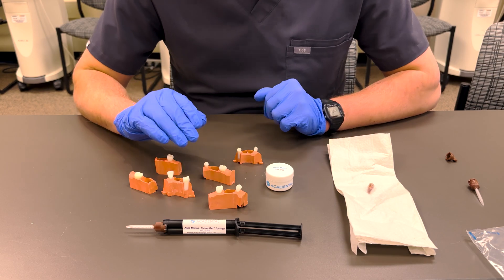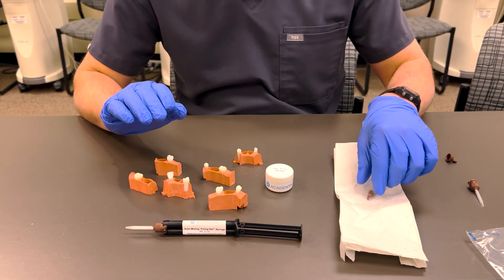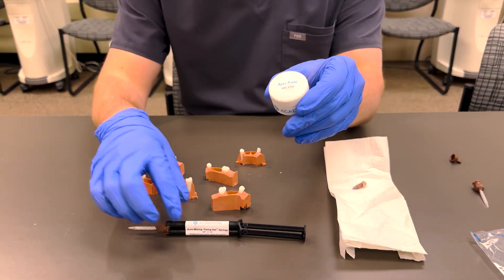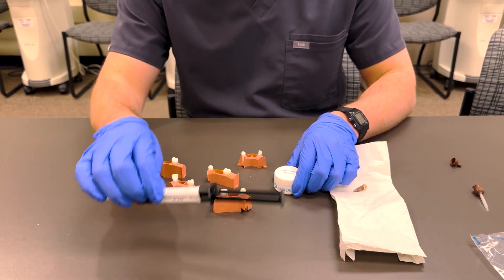In order to mount your teeth, you're going to need a few things: your actual physical extracted teeth, your sextants, apex putty, and fixing gel.